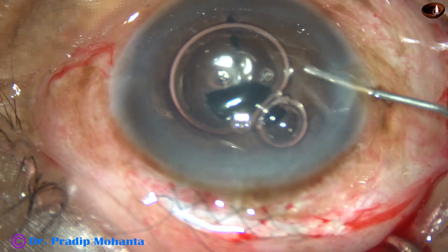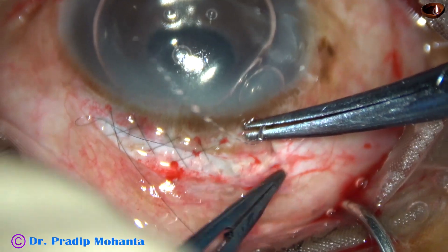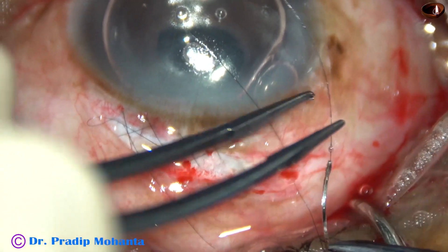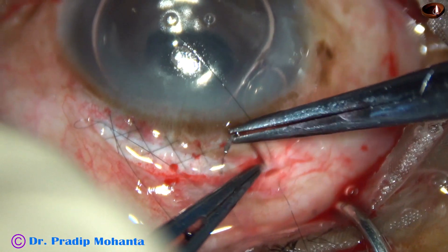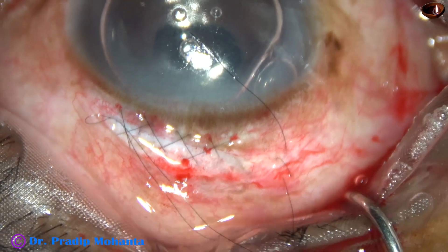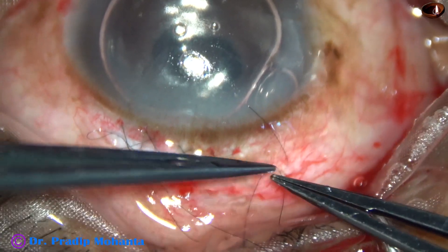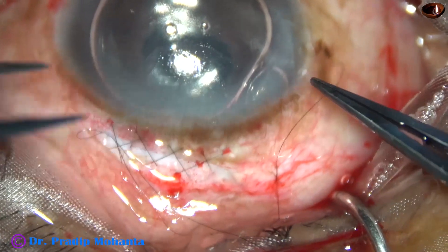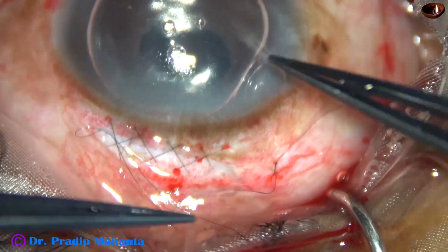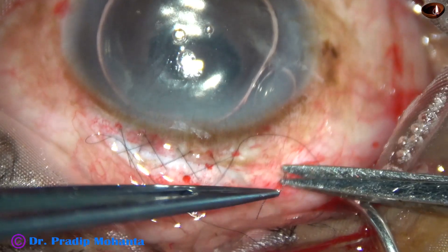Now I inject some air in the anterior chamber. And now I close the sclerotomy wound. This is an X-suture — two bites — and I just put the knot. This is a 10-0 nylon suture, so 10-0 nylon can be used for closure of sclerotomy.